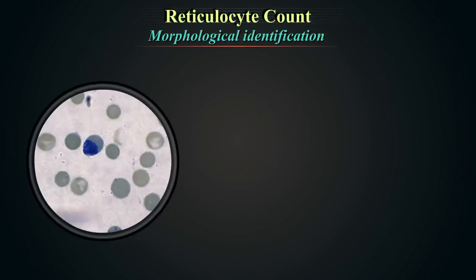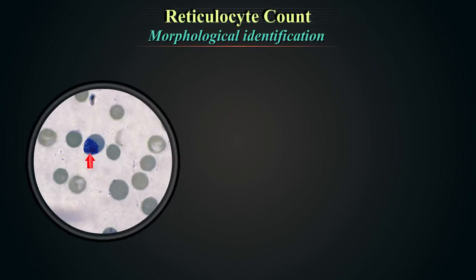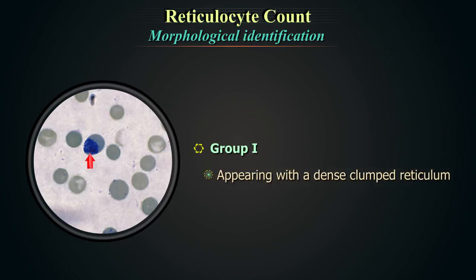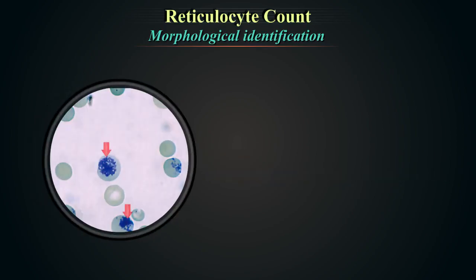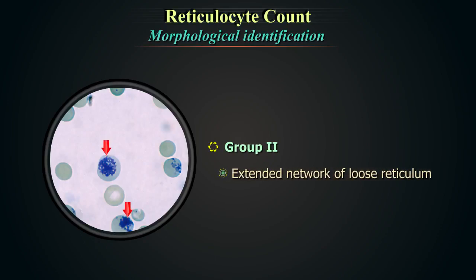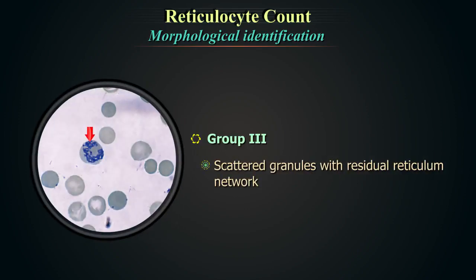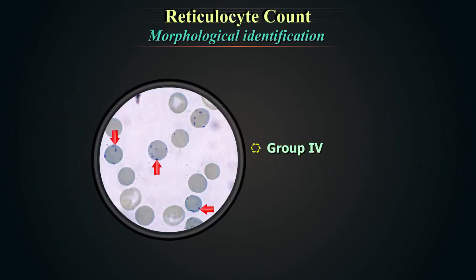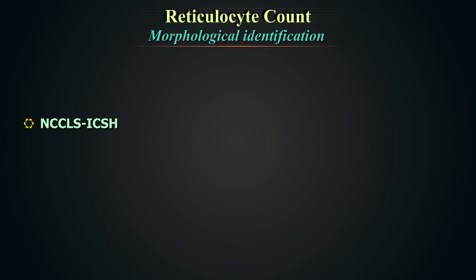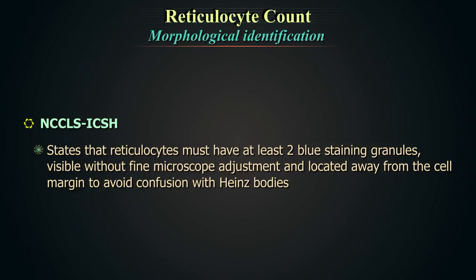Now let us look at some microphotographs to identify reticulocytes and stages of maturation. Group 1 reticulocyte appears with a dense clumped reticulum. Group 2 reticulocyte shows an extended network of loose reticulum. Group 3 shows scattered granules with residual reticulum network. Group 4 shows scattered granules with no residual reticulum. The NCCLS-ICSH definition requires at least two blue-staining granules, visible without fine microscope adjustment and located away from the cell margin to avoid confusion with Heinz bodies.